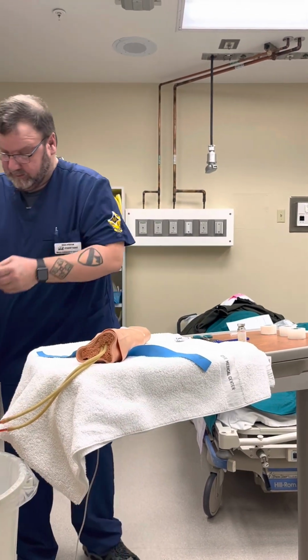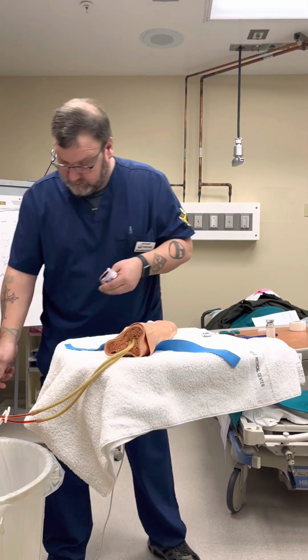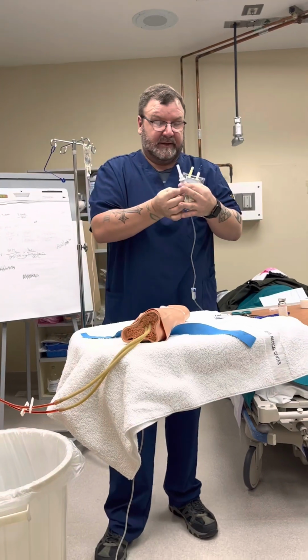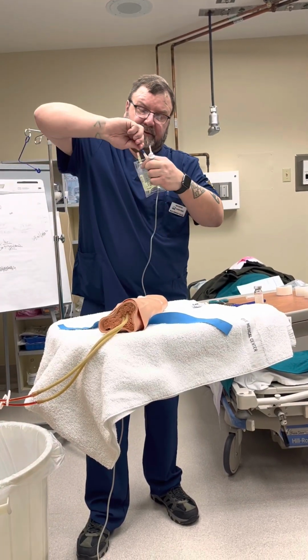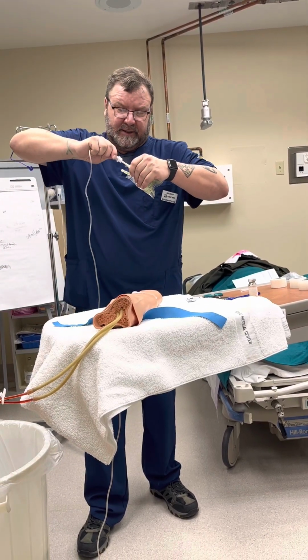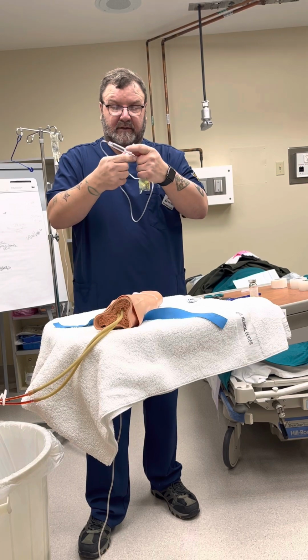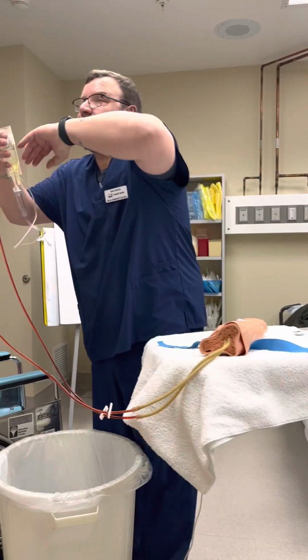Okay. So I've got my administration set. So without touching the spike, using my aseptic technique, I'm going to remove that cap, pull that off, push in and twist. Make sure this is closed. That could have been close. It was not closed. Making sure that's closed.